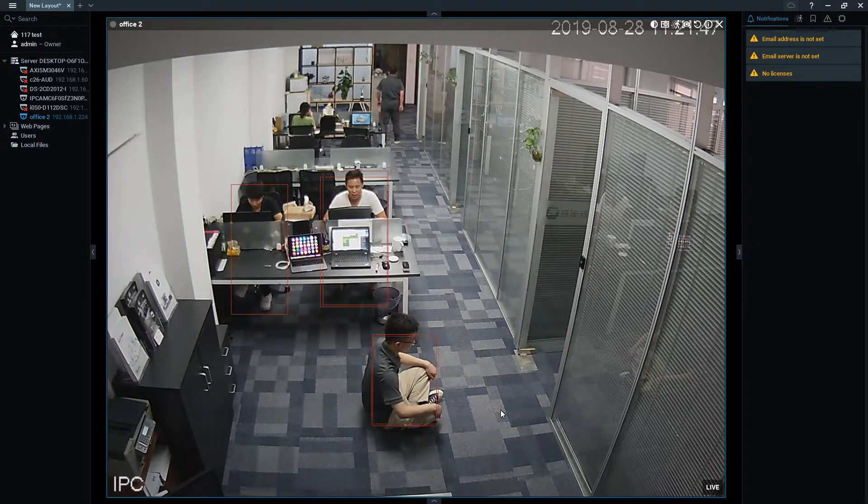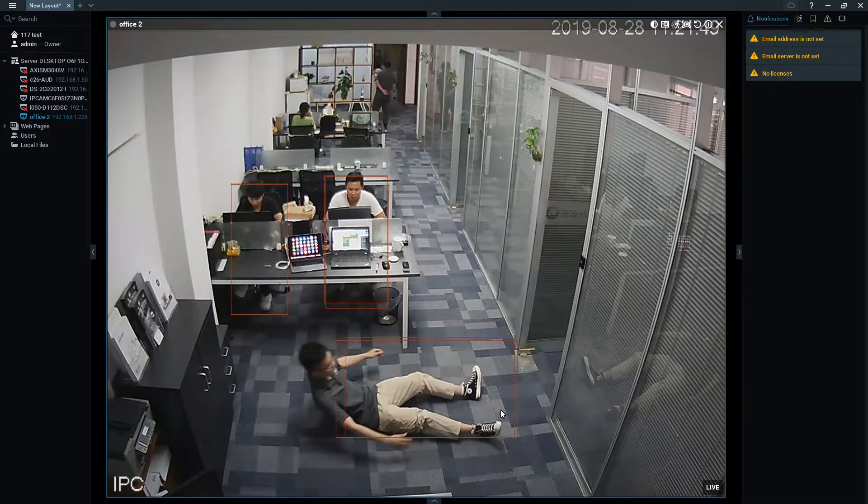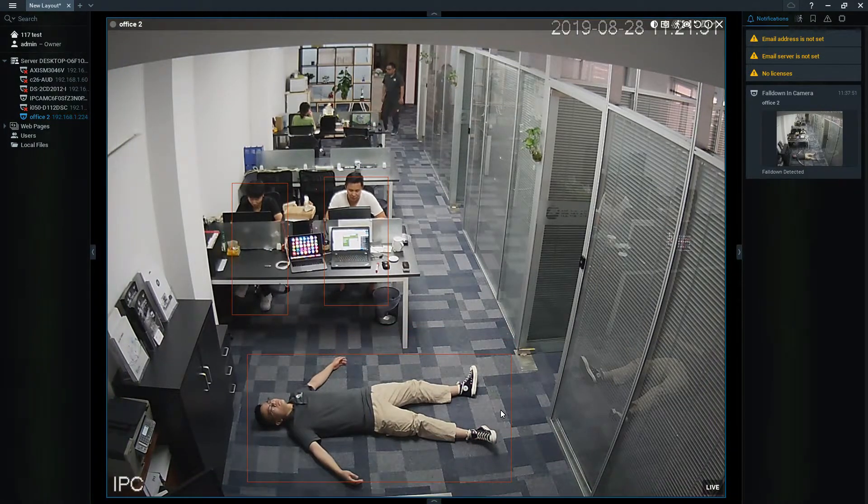What if he falls back on the floor when he is sitting down? The alarm will go off.